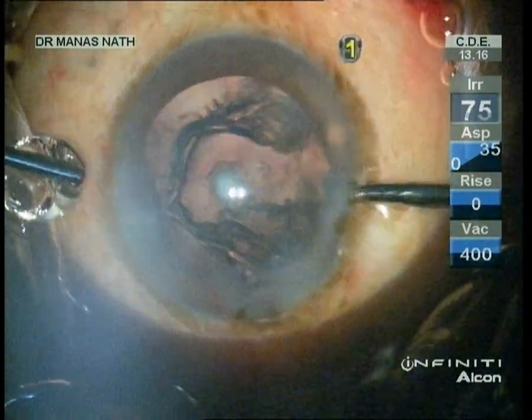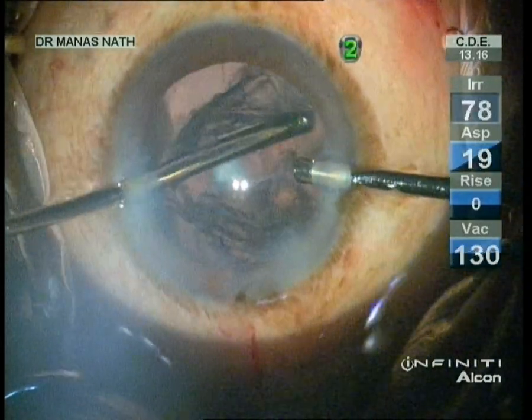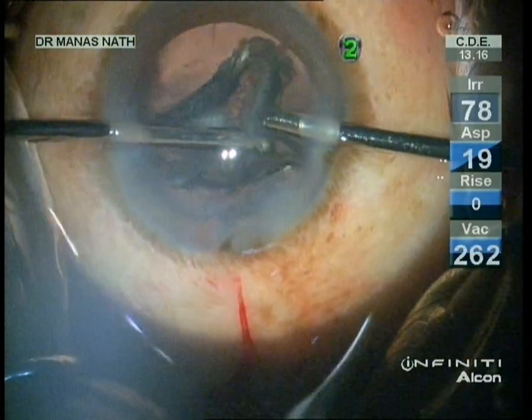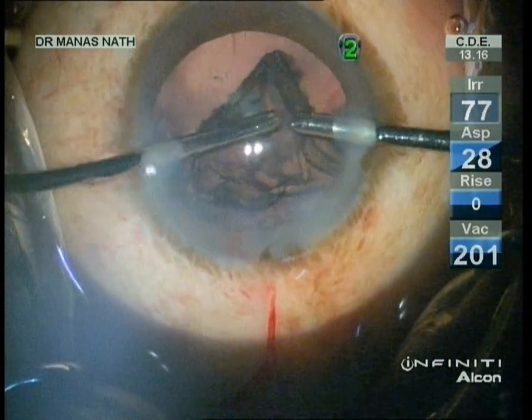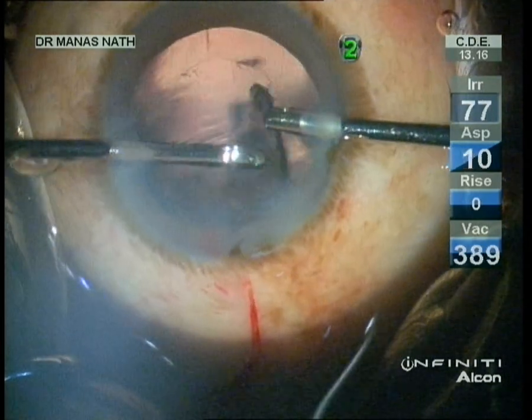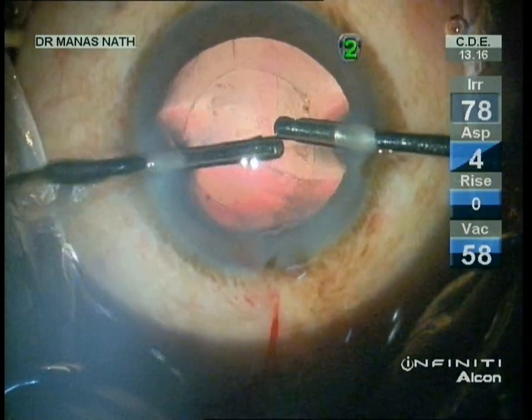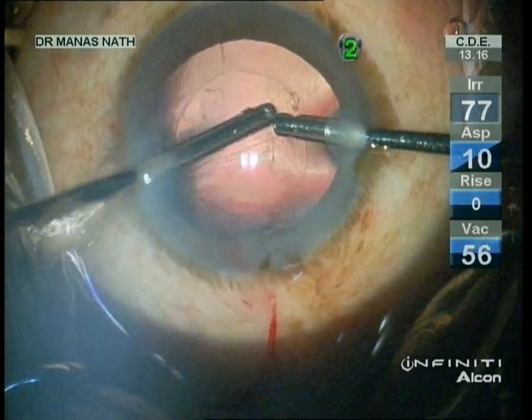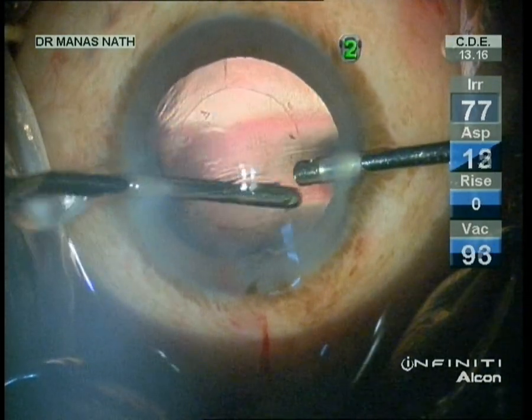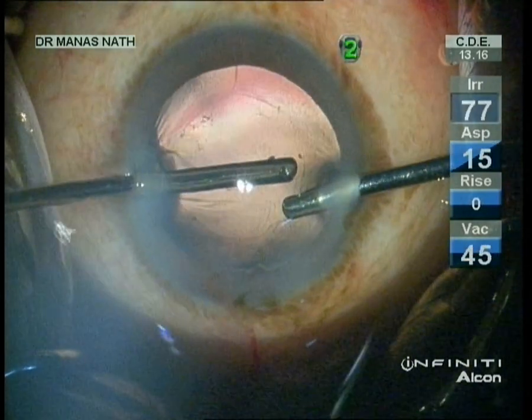Putting viscoelastic so that I can switch my cannulas. Once most of the cortex has peeled out from the periphery, it's time to take out the central part as well. You can see that the posterior capsule looks intact. I'm removing some of the cortical fibers still attached there. Better not to touch the central area, which could be thin and can easily give way.